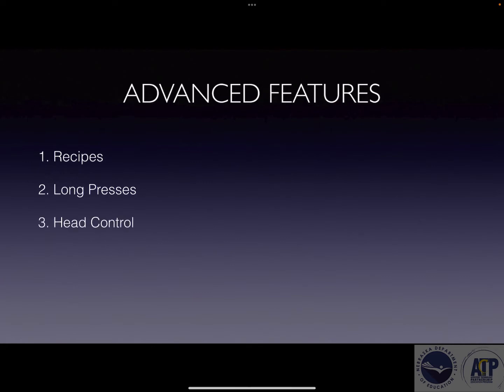Head control. We briefly talked about that a little bit earlier, but it's the ability to use your head to control basically a mouse on the screen and move around the screen with that and make selections by using facial expressions. Gestures, the ability to capture gestures and utilize those gestures within specific apps that those gestures will make sense in.